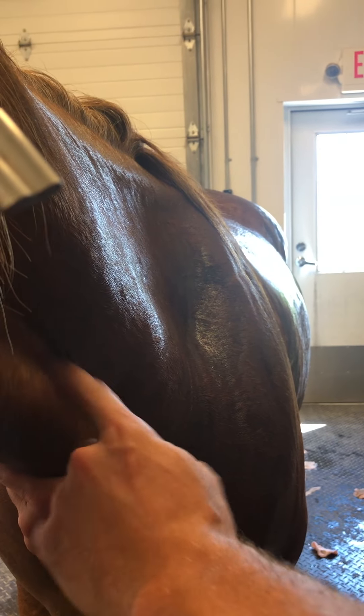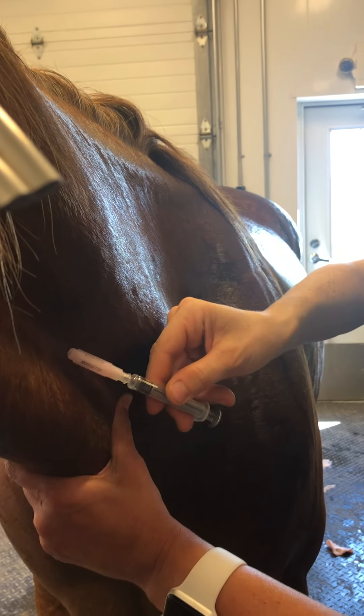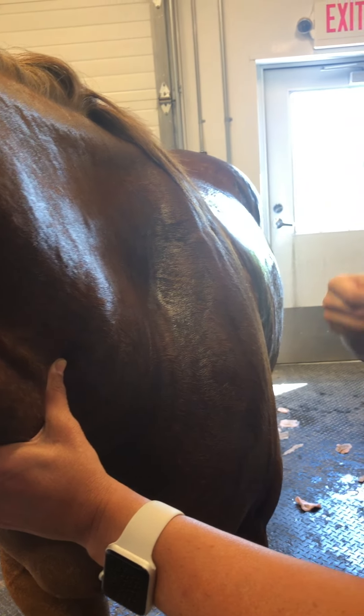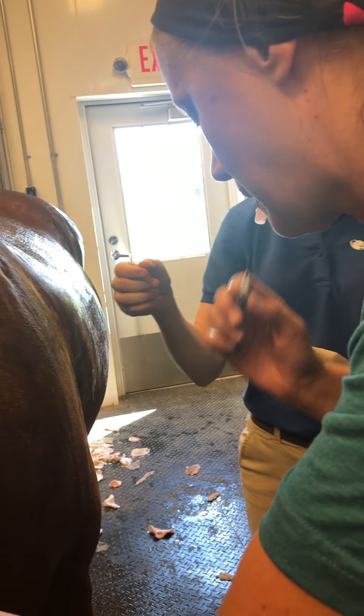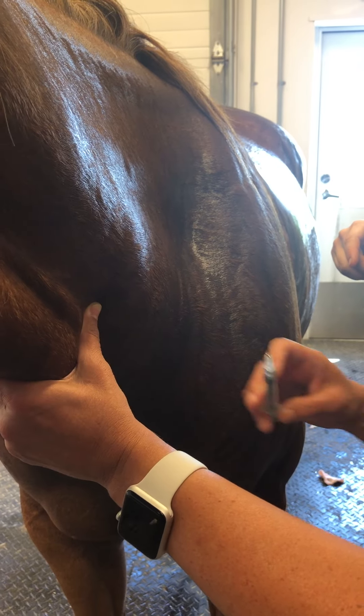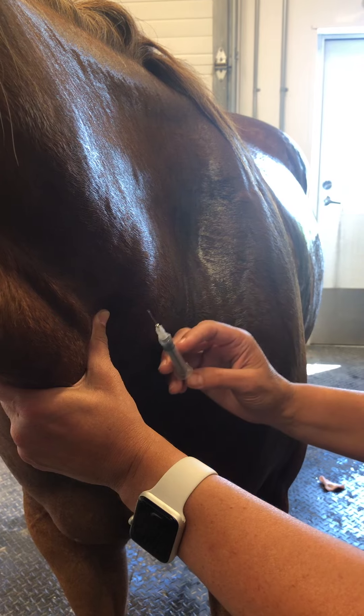There you go, there it is. So you're gonna just lace it up through here. You're gonna take it — you can take it. Don't pull. Go ahead and lace it, and don't give it right away, just get the needle in.